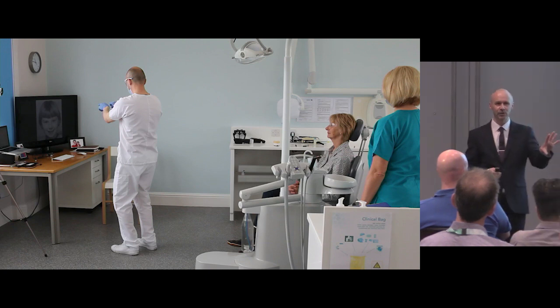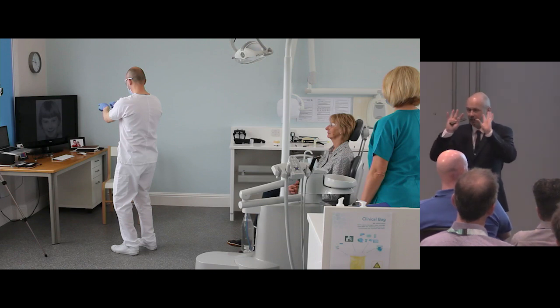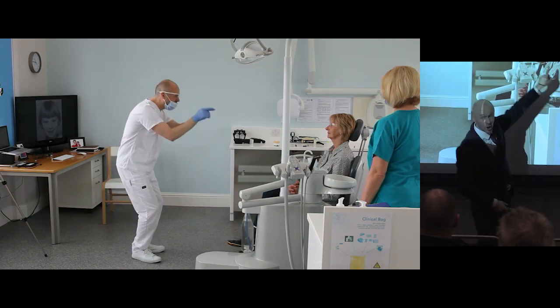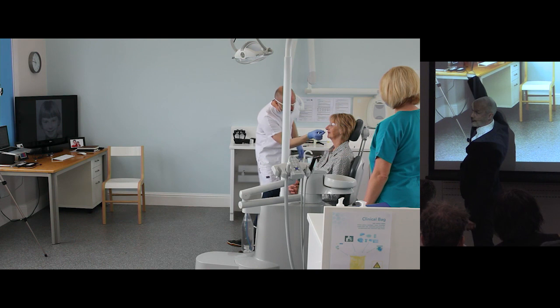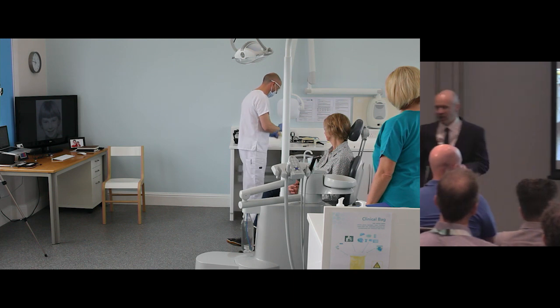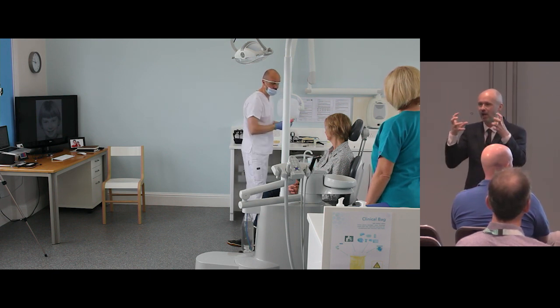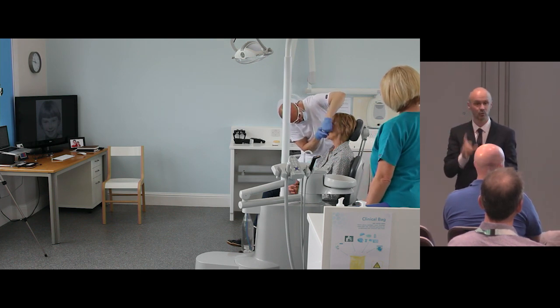So in order to recreate that natural look, I have to try to visualize the patient. Here we've got Julie. Julie's got an upper wax rim in place here, and I'm using this photograph of Julie with her natural dentition. She's at the age of 12. I have to try to imagine what Julie looks like if she had her natural teeth now, and get a mental picture of her with her natural teeth by carving that rim in a certain way.